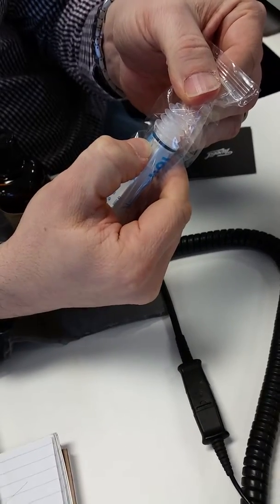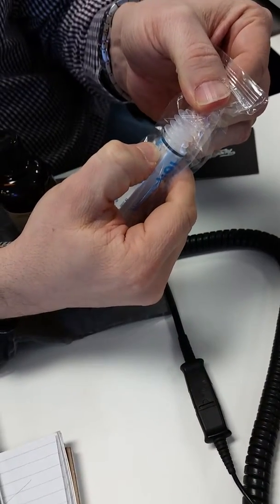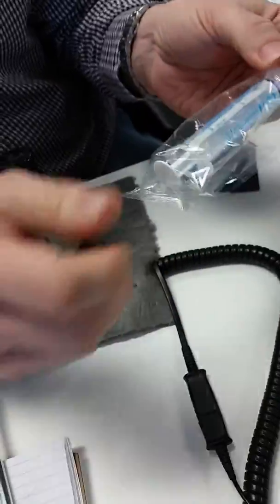Pull. Millimeter... milliliter. Start with one milliliter. And then pull it out.